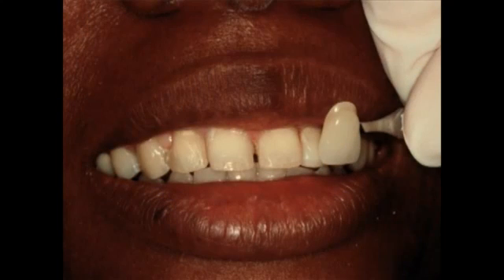I want to show you the before picture again, and I want to bring your attention to the enamel highlights on tooth number 10, more on the mesial, an enamel highlight towards the mesial of tooth number 9, a number of enamel highlights in the center of tooth number 8, and a series of enamel highlights on the mesial of tooth number 7. This is the pre-op picture.